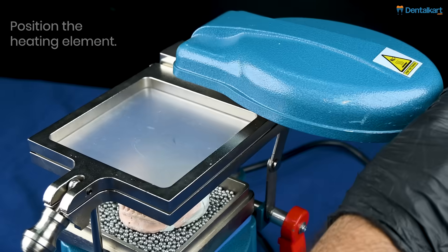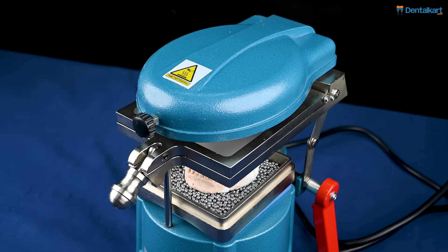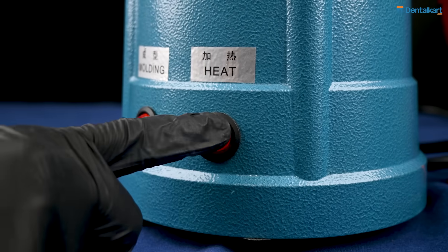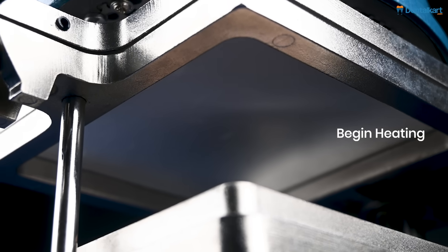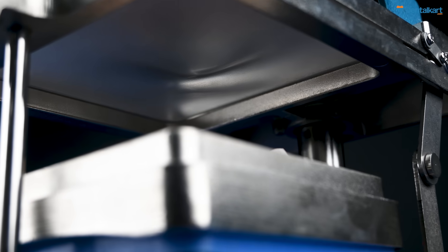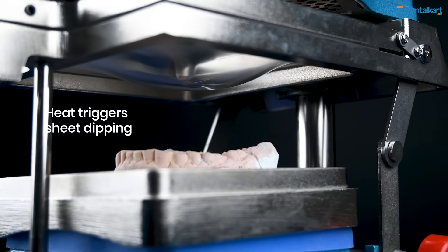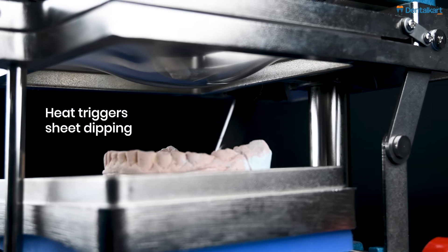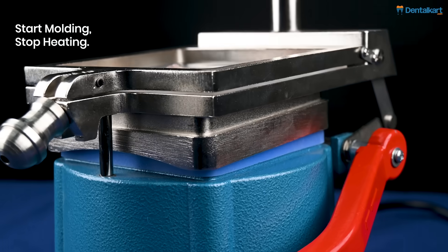Once the sheet has been stabilized and the heating element is in place, the heating action is started. With time elapsing, the heating action will cause dipping of the sheet. Once the right time has elapsed, start the molding and stop the heating process.